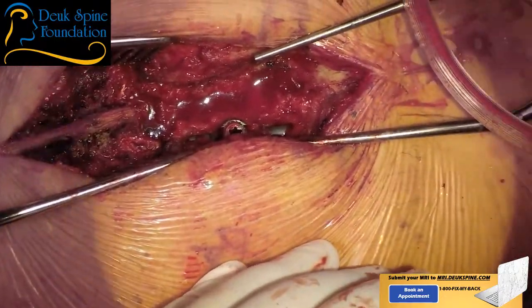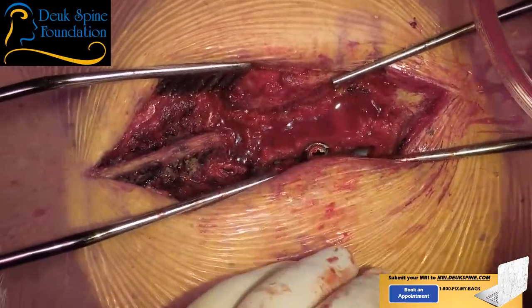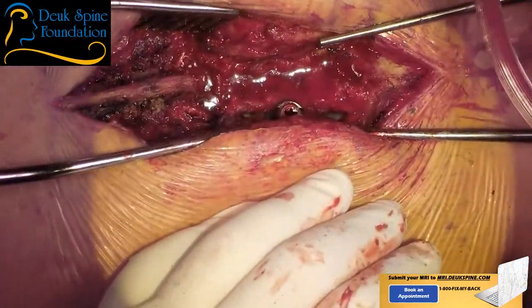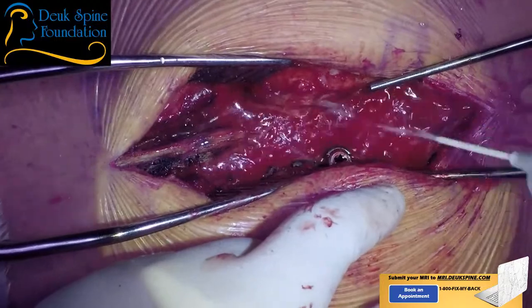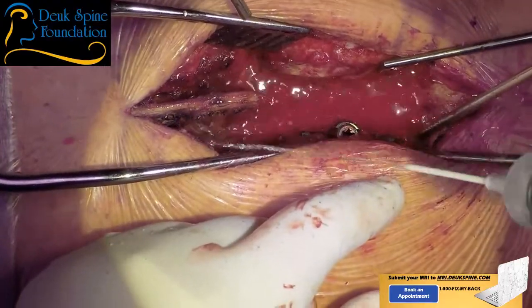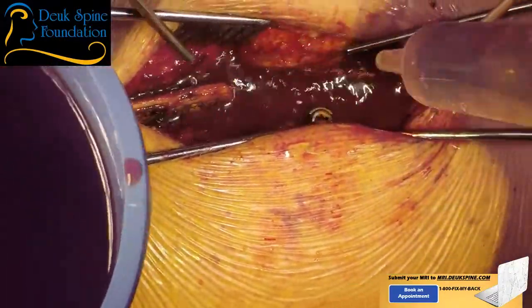T9 to T12. Let's put a drain. We're putting the bone graft right now. We have Exparel? We have Exparel. We're going to put the Exparel. We're going to put a gram of Vanc. Maybe not a gram, half a gram. Irrigation? Yes, sir. Suction? Just suck where you don't get the Gelfoam. We're going to do irrigation, bone graft. Oh, so you do have some proper irrigation. Betadine.